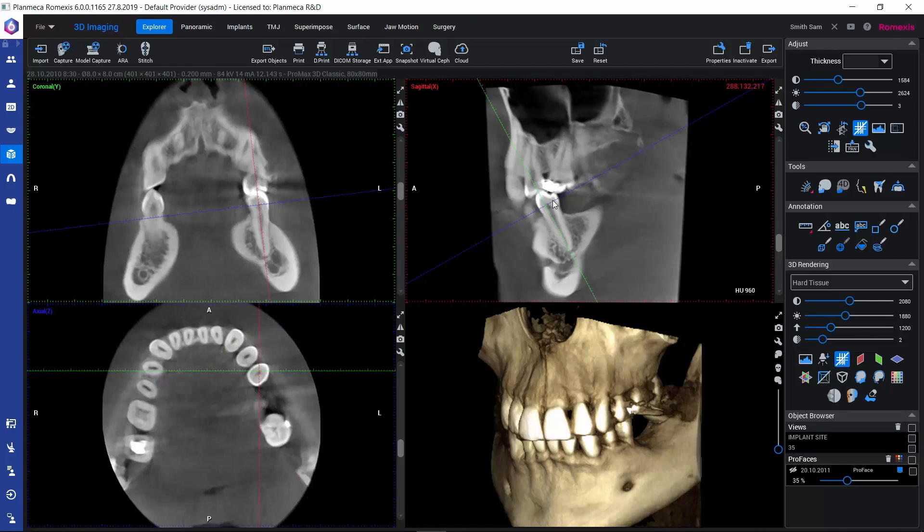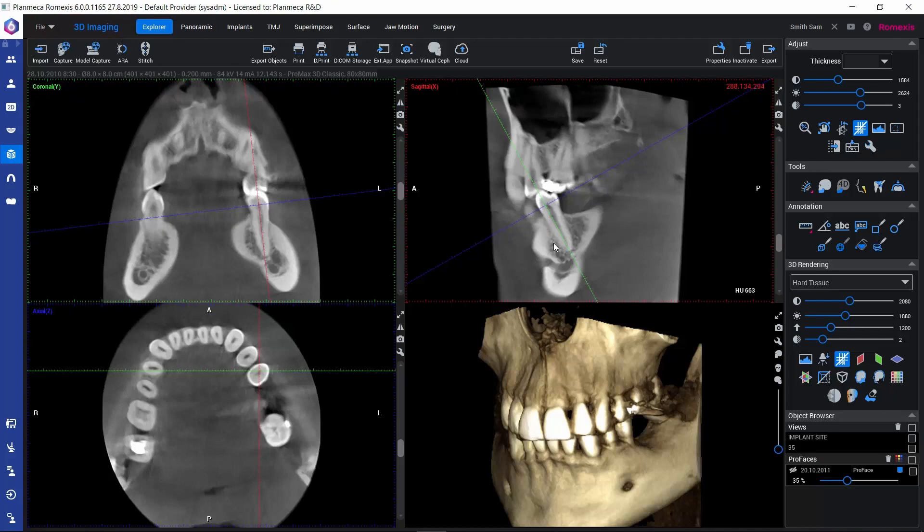So this is our way of saving findings inside the 3D module. If we close the volume and reopen it again, we can always go back to these views by clicking on these links here under Views.